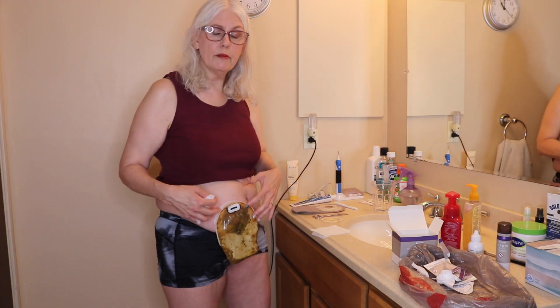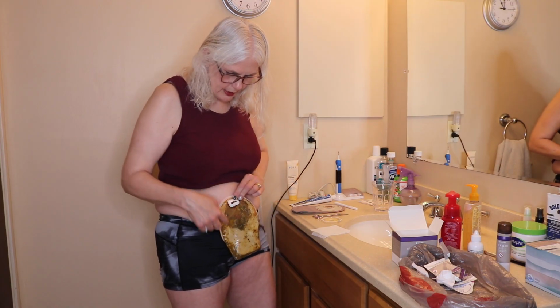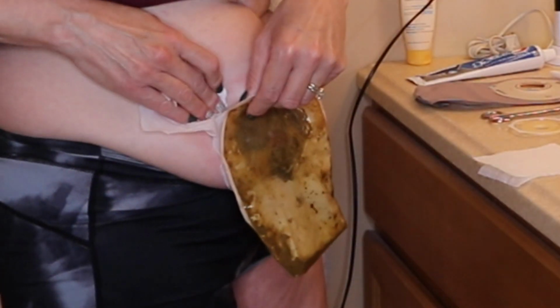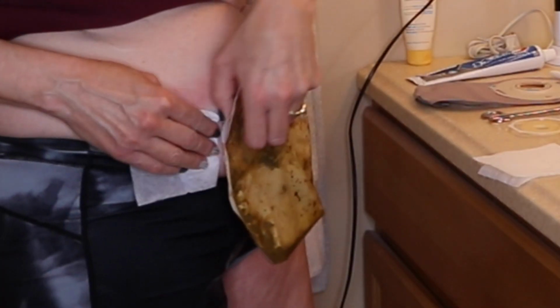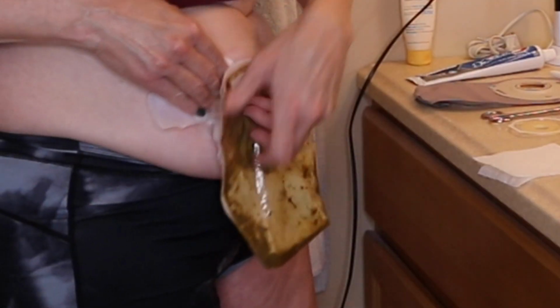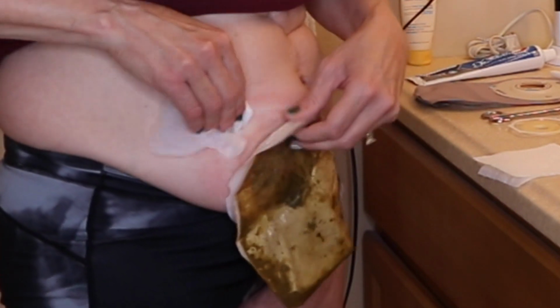And then I've worn them. This is the second one I've worn, and it's been fine. I haven't had a leak, even though I've had some of the pancaking up in this area. But I think it's thick enough, whereas before I had more thinner output, more watery. So because this is thick, it's been okay, but yes, it's all separating from this ring.